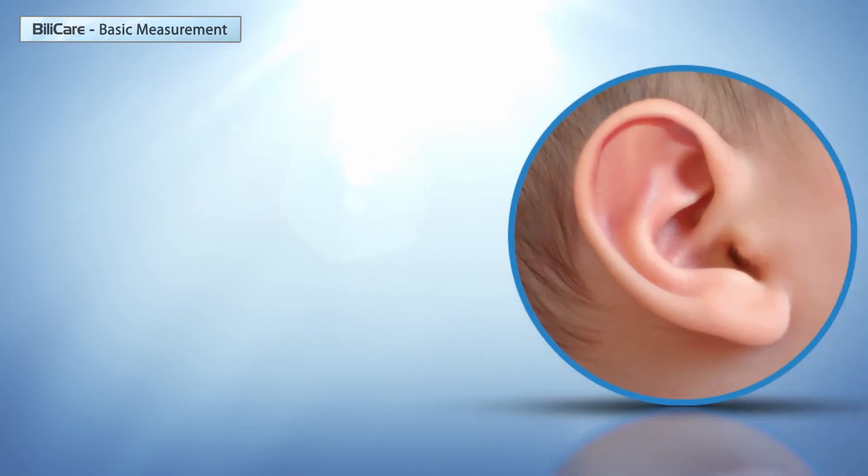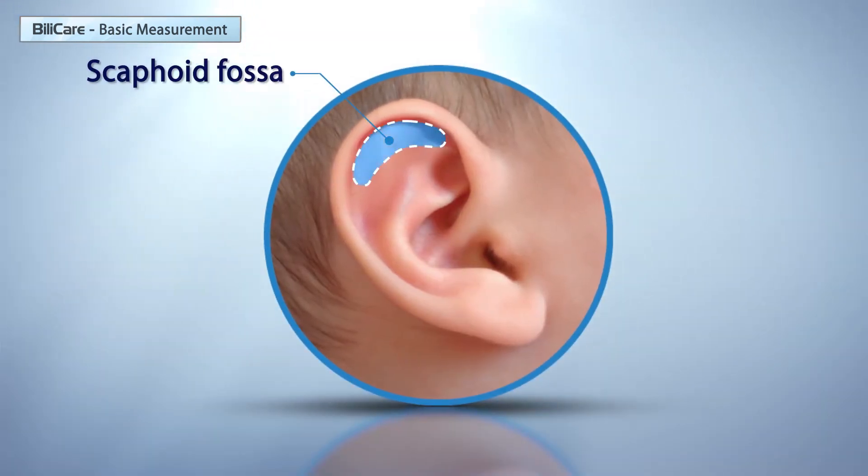Place the sensor on the upper side of the ear, in the scaphoid fossa, where the thickness is most consistent. Avoid placing the sensor on folds or malformations.